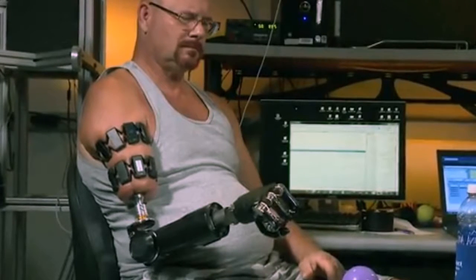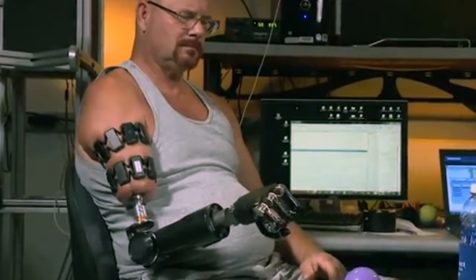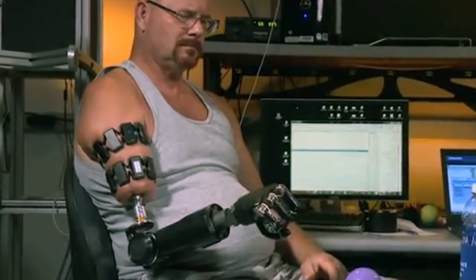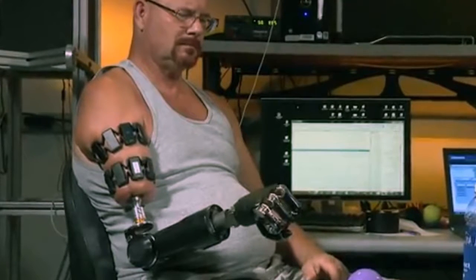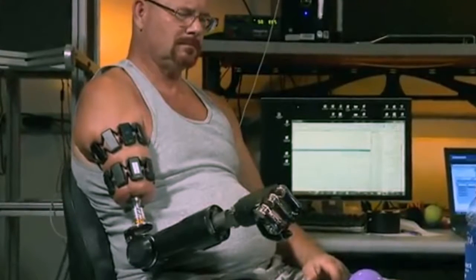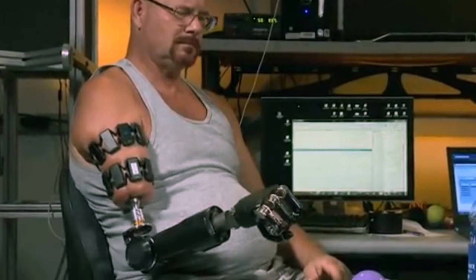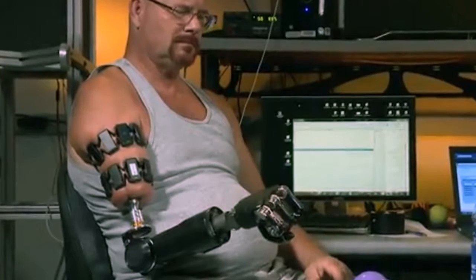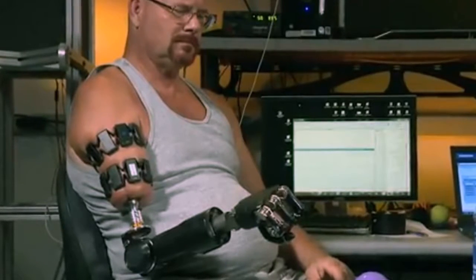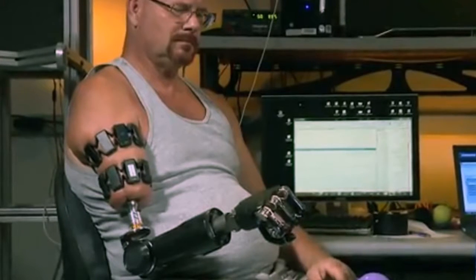Johnny Matheny lost his arm to cancer in 2008, and has since pioneered the advancement of arm prosthetic technology. The new system replaces the need for harnesses when working with the modular prosthetic limb, MPL, which can be uncomfortable after prolonged wear. For Matheny, it has helped to return many natural motions. "It's all natural now," Matheny says after his first trial run using the MPL with the new implant.